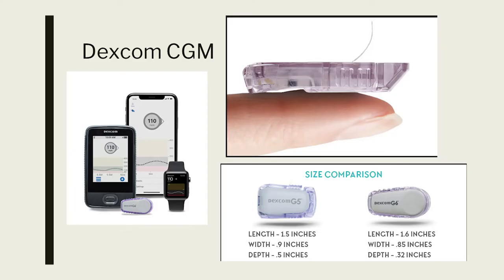They function via this catheter that sits right there, under the skin in the interstitial space. I kept trying to show my parents the catheter, but I couldn't get the light bright enough for them to see it. And I couldn't find a magnifying glass, so they never were able to see the catheter. It's probably twice the diameter of a hair, but very, very small.